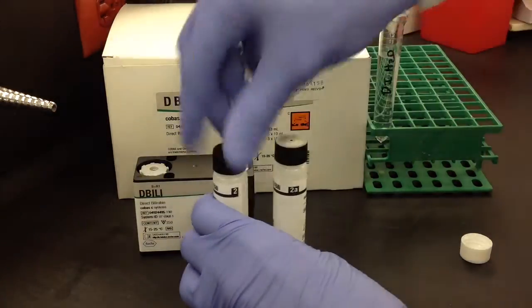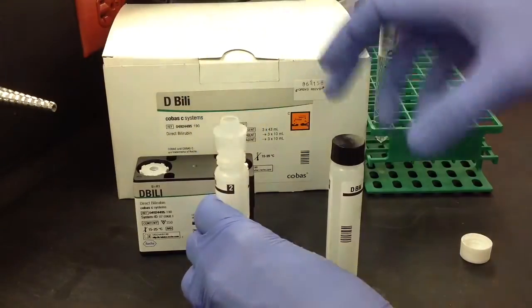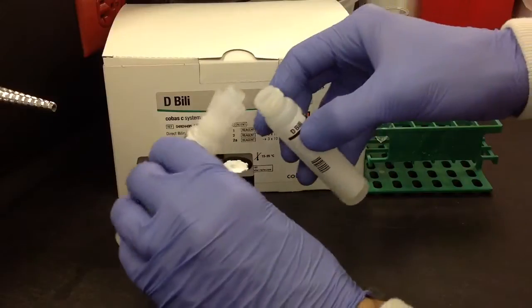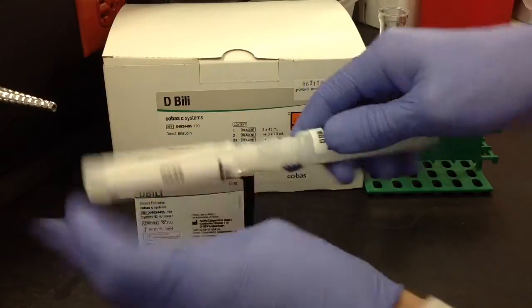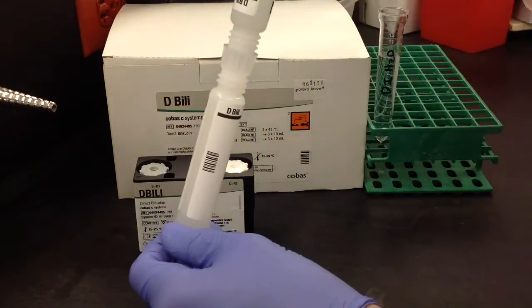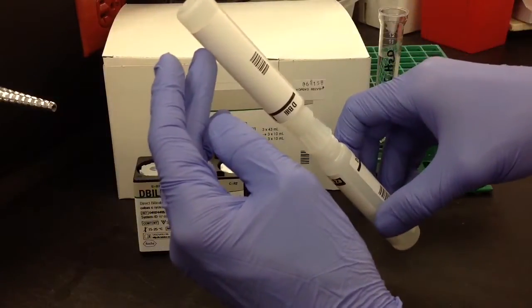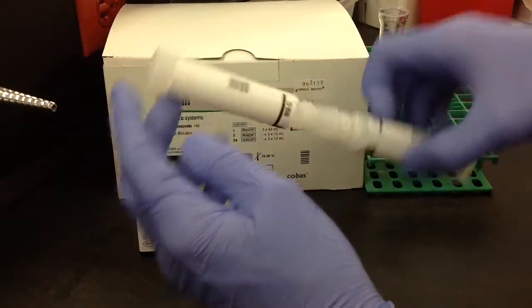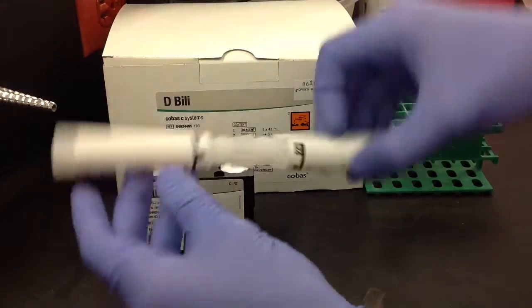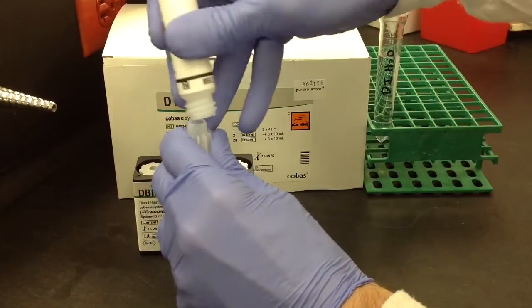The next step is going to be taking 2 and 2A, and you're going to use a connector to connect the two. After you have them connected, go ahead and mix back and forth 10 times. Then after you're done mixing, just go ahead and get all of the reagent into one side, and then go ahead and remove the other — which I did 2 in this case.